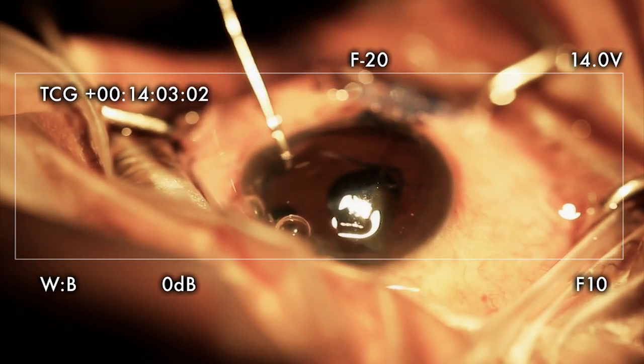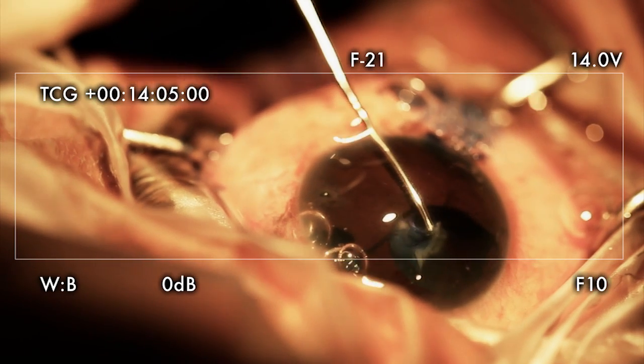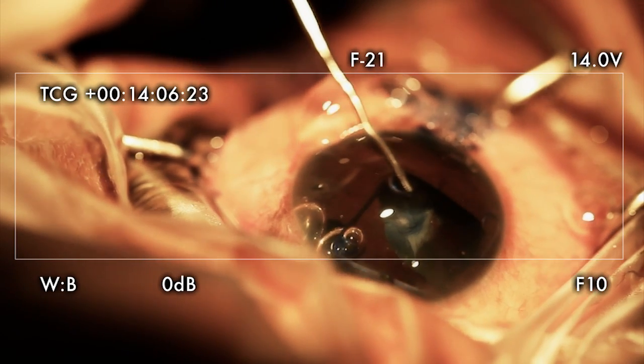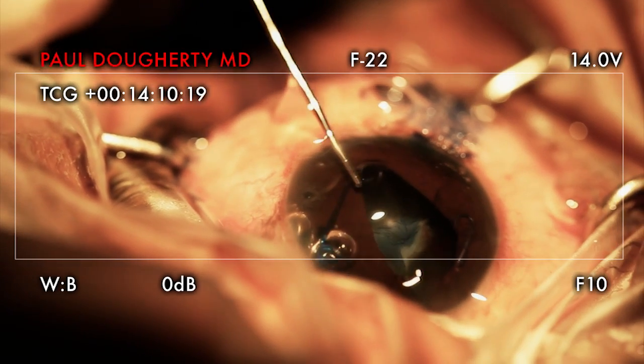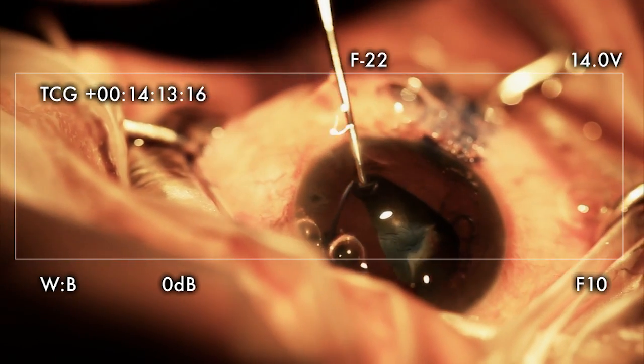I used to cut the iris on these cases, but I find the ring is just... yes, it gets me better exposure. That's perfect. And less damaging. You have a teaching scope now — that's perfect.